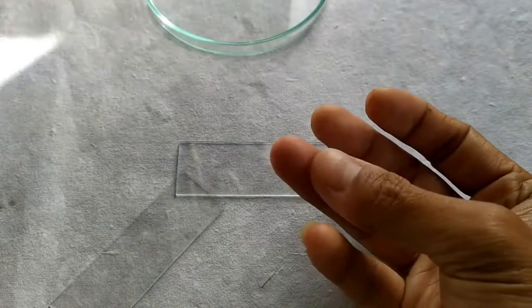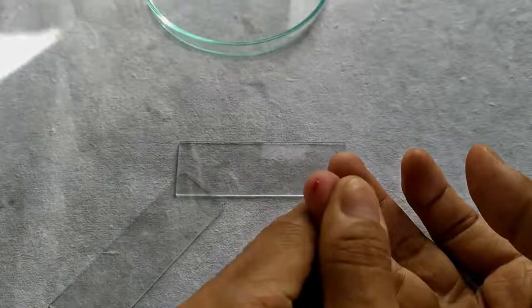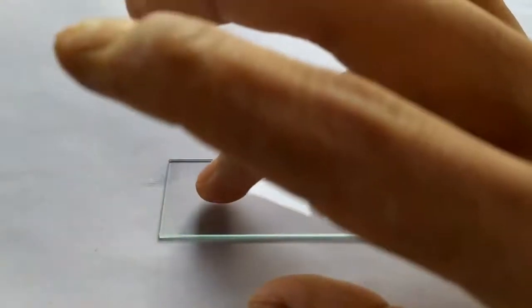To begin the DLC procedure, first prepare a thin peripheral blood smear of the given blood sample and stain it with an appropriate dye solution.